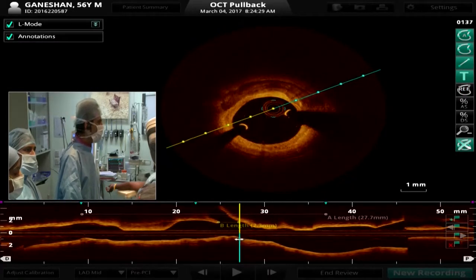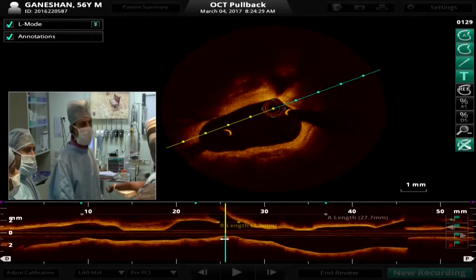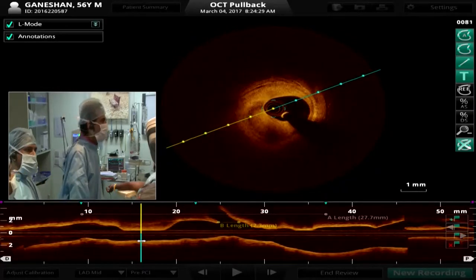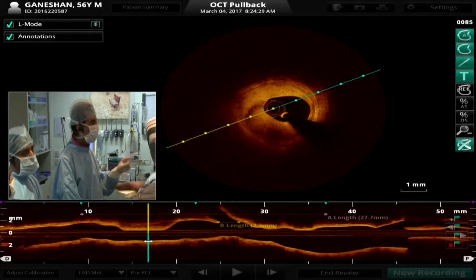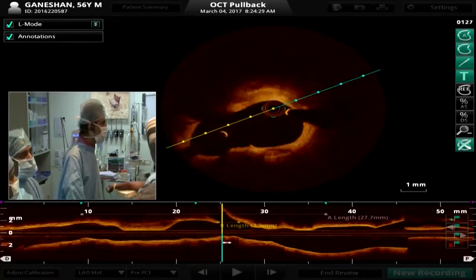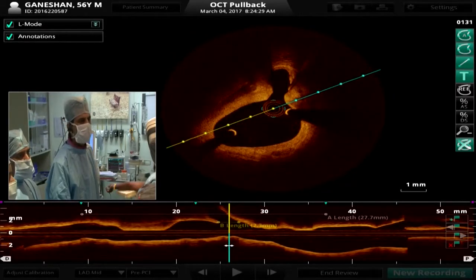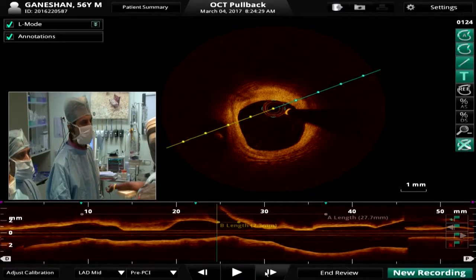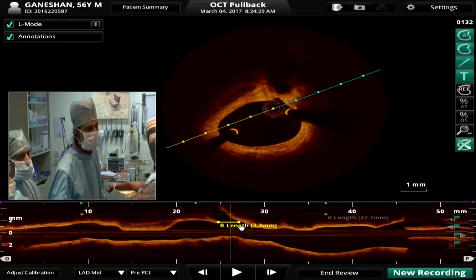We definitely have to consider aggressive predilatation, particularly at that point. And distally, there is some amount of organized thrombus. So we need to concentrate on the lesion just above the diagonal, which appears calcified. The second is the diagonal ostium does not appear to have much disease. So that's provisional. The length of the ostium is 2.3 millimeters.